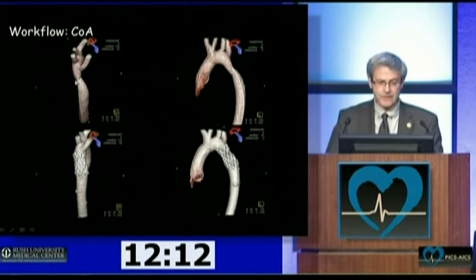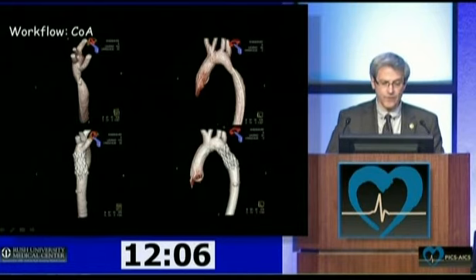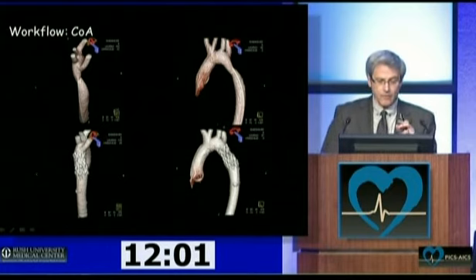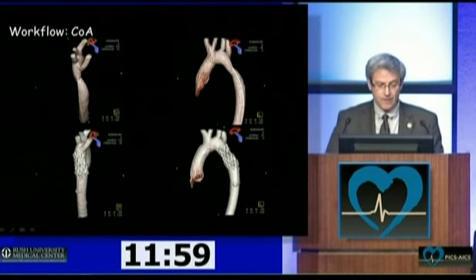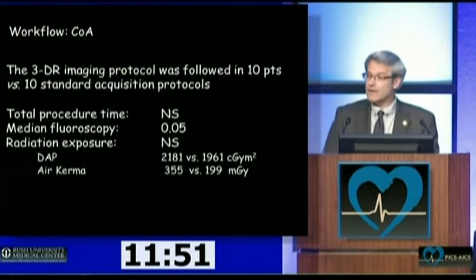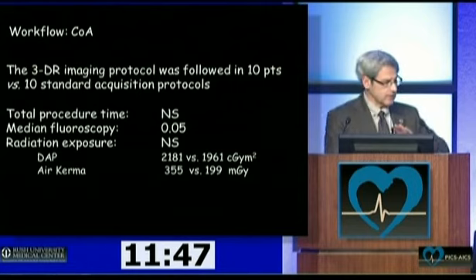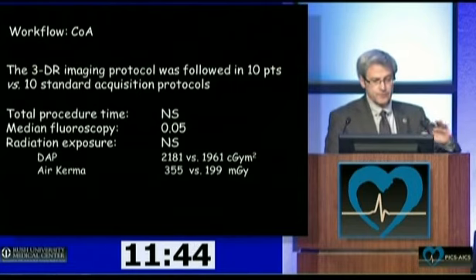Very, very sophisticated application of understanding the topology of where the head and neck vessels are, where the stenosis is, and very nice information about what you've actually accomplished with the stent and whether the stent is involving other vessels that you should be aware of. So it's very good information. But the goal here is to change the workflow to streamline the procedure.